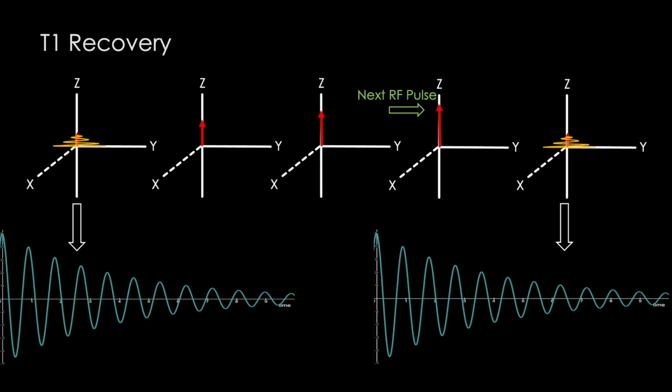We then have to either make it re-emerge as an echo or wait for it to rebuild in the background, which we can't see, before exciting the system again with another RF pulse. This may seem like a small detail, but conceptually means all the difference in the world when trying to understand T1 and T2 contrast. Check out the dedicated lecture on T1 contrast for more information. Link above, and do not fall for this conceptual and very pervasive misleading visual.